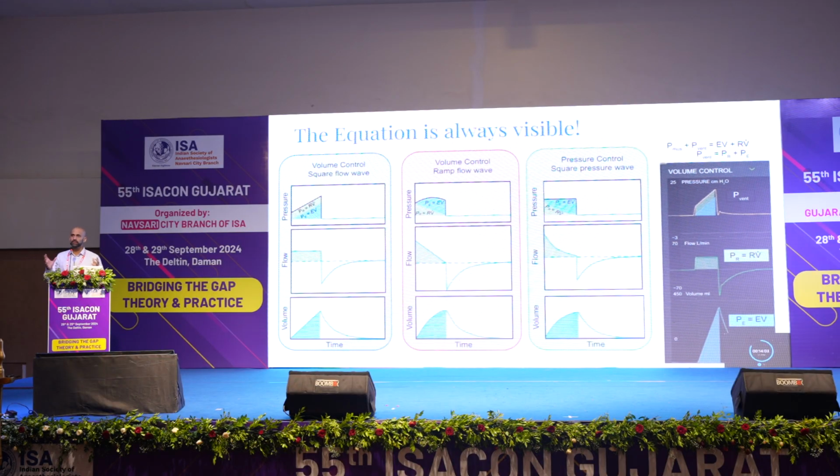The equation of motion, some of you who are in training and others who are more on the respiratory physiology side will be familiar with this equation. Pressure on one side, resistance times flow and elastance times volume on the other side. These are the two hands of the equation.